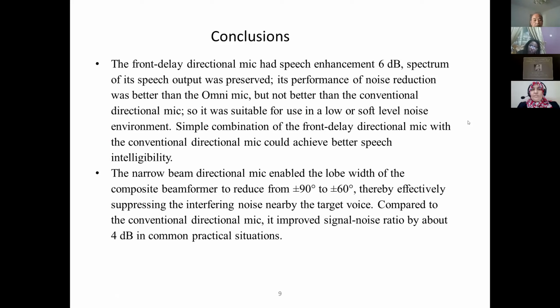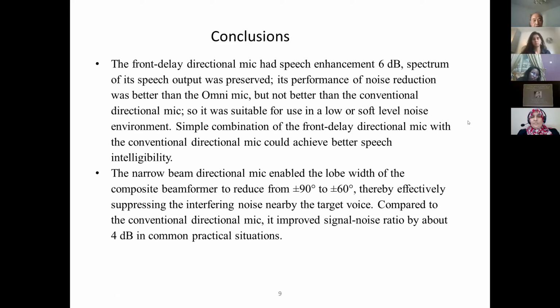So it was suitable for use in a low or soft level noise environment. Simple combination of the front delay directional mic with the conventional directional mic could achieve better speech intelligibility.